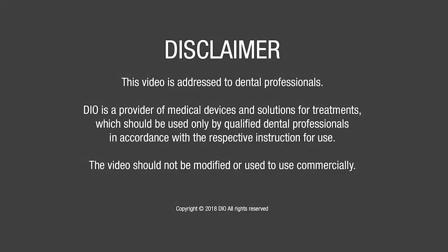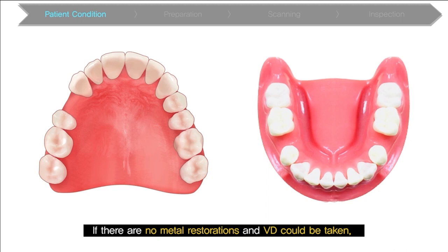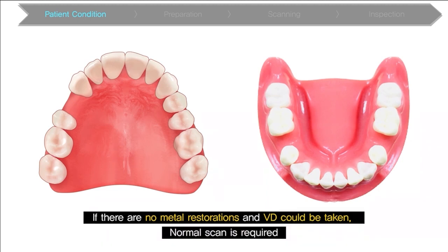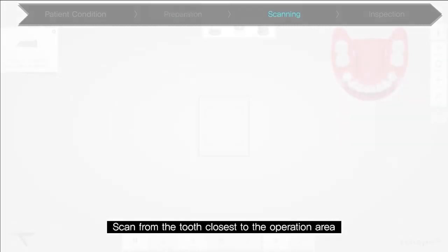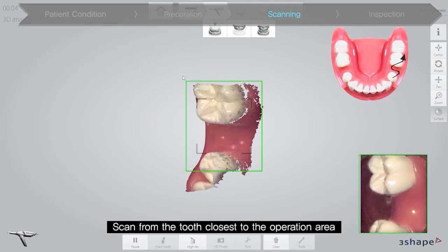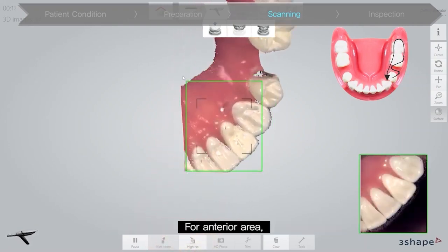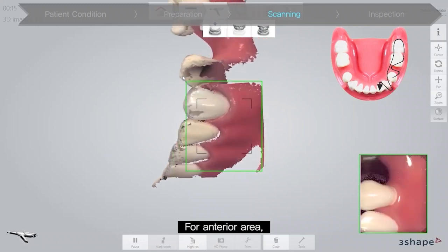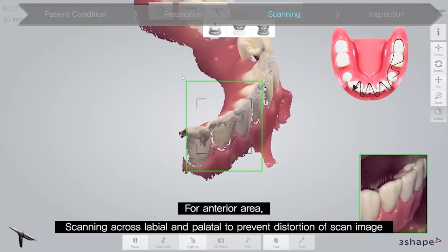Let's look at the scanning process of a normal case. The first step is to check the patient's condition. If there is no metal restoration in the mouth and VD could be taken, you can use a normal scanning method. This is the Trios scanning method. The scanning should always start from the area closest to the surgery location. For the anterior, scan across the labial and palatal area to prevent distortion of the scan image.